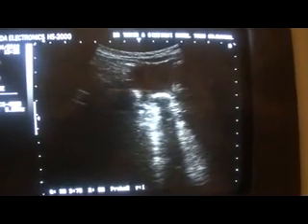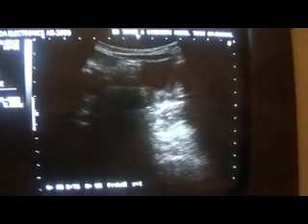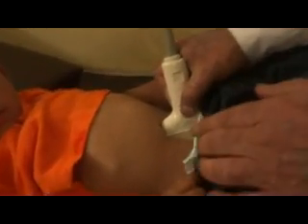Now the important thing to note is that in kids you will always see that the central sinus echo complex will be present, but it will be rather muffled. Now this is the area of central sinus echo complex. It is present. The fat is seen, but is not as dense as you see in the other kidney, and its amount is also less.